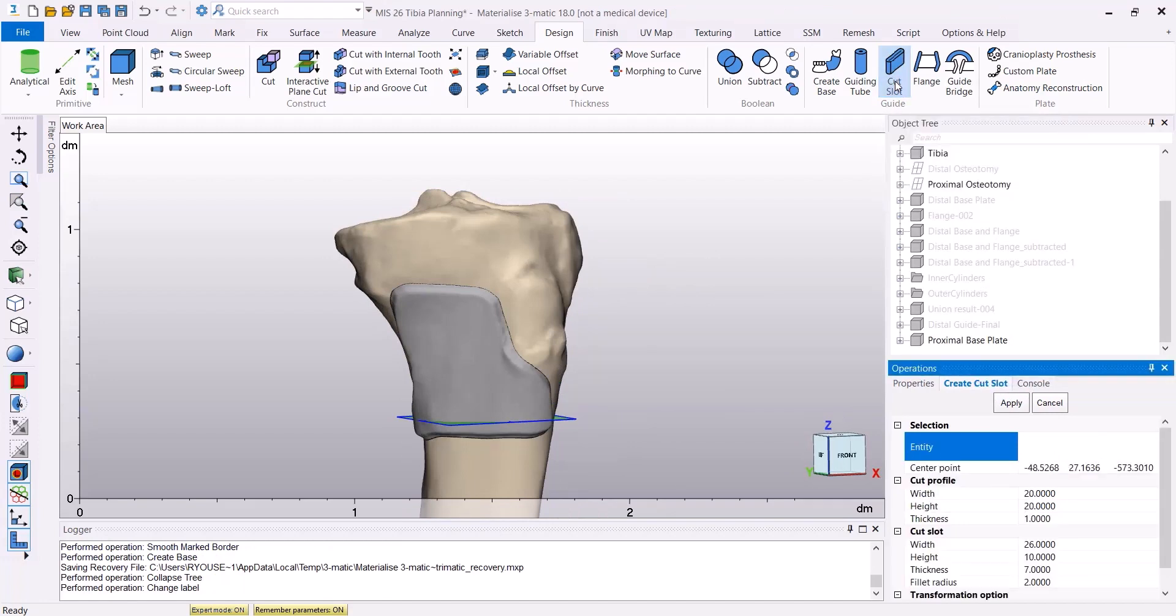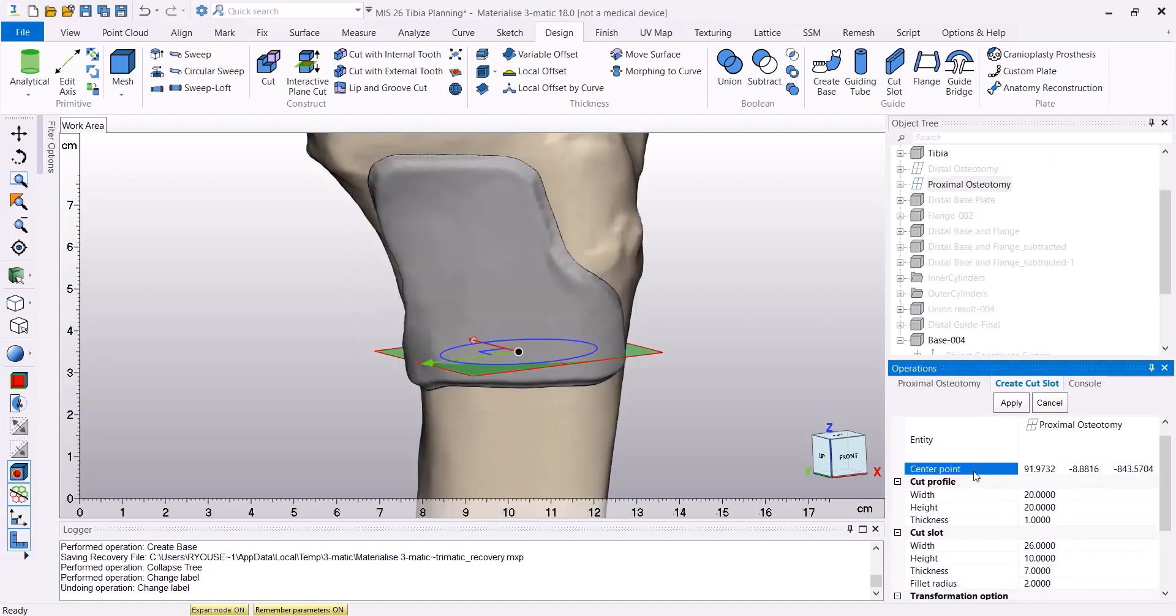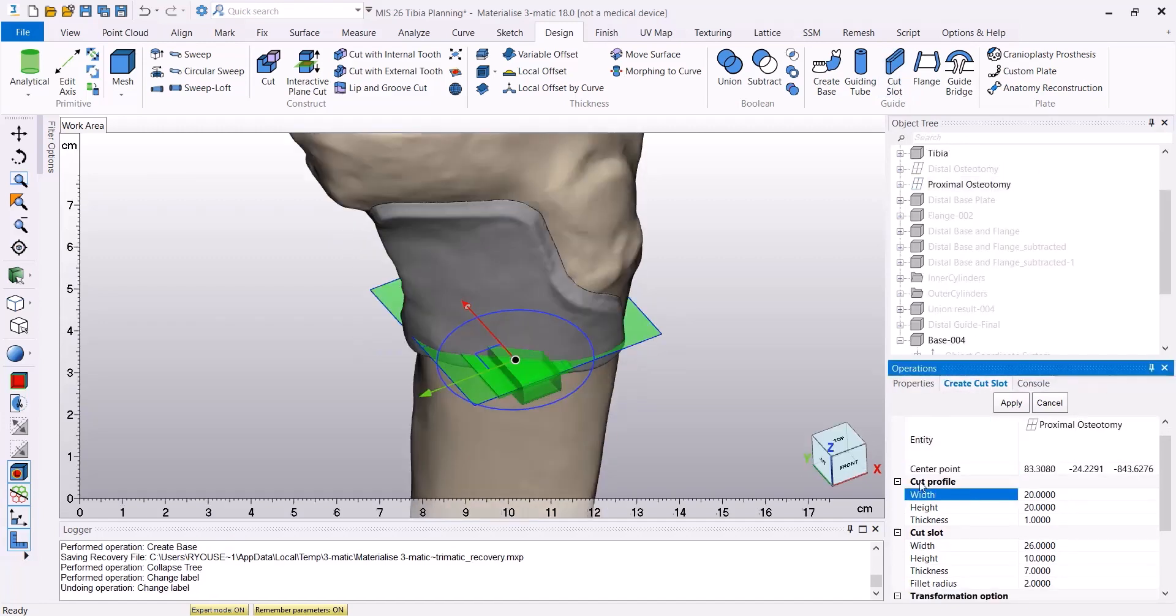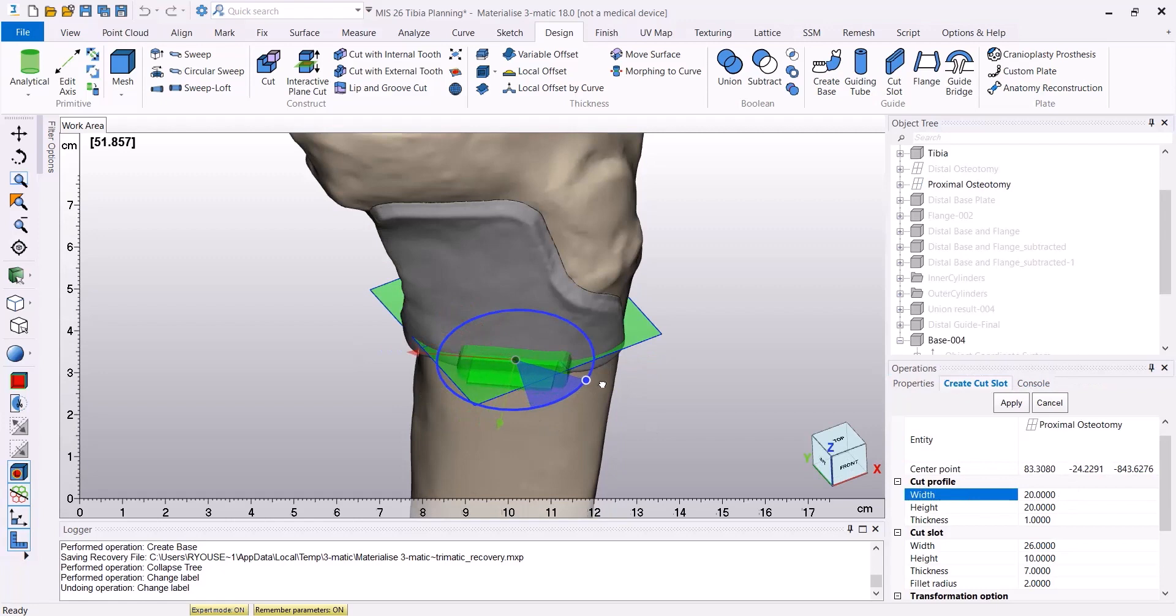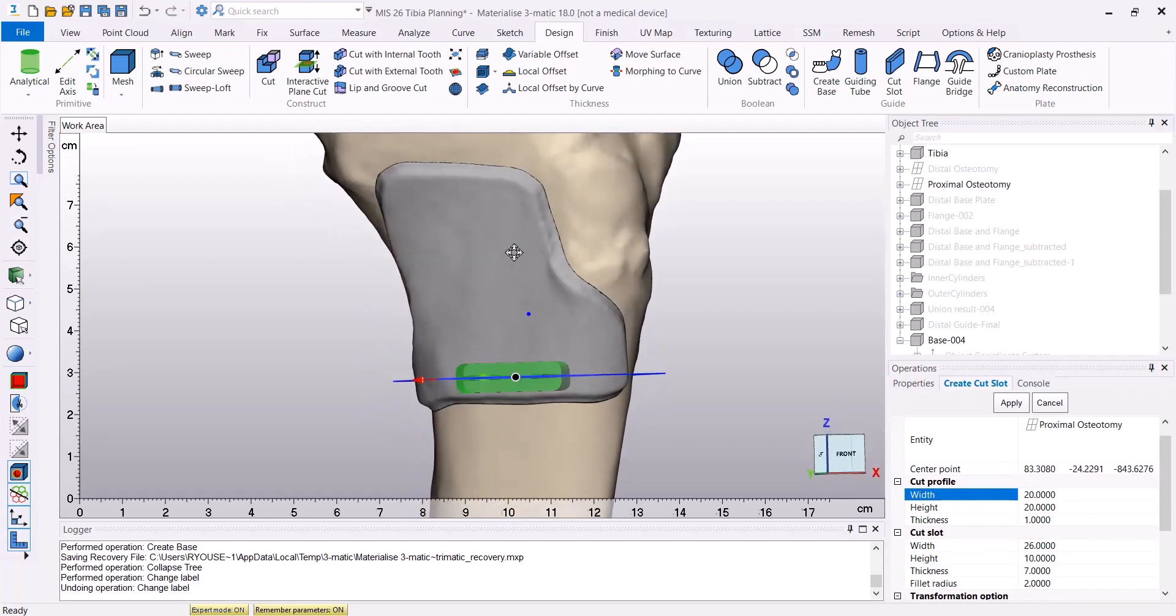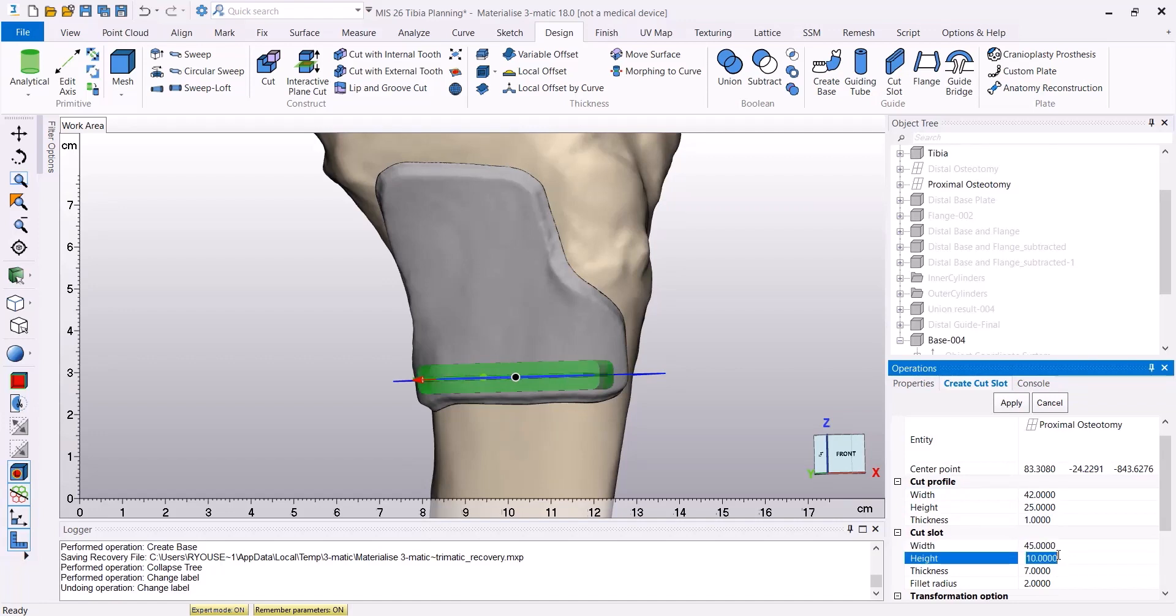And we're going to use the Cut Slot tool to create a cut slot on the surface of the base. As entity, we're going to choose the proximal osteotomy. The cut slot can also interactively be moved around just to make sure that it fits perfectly on our base. And we are also going to change the values for the width and height to make sure that it's a perfect fit for the base that we have created.